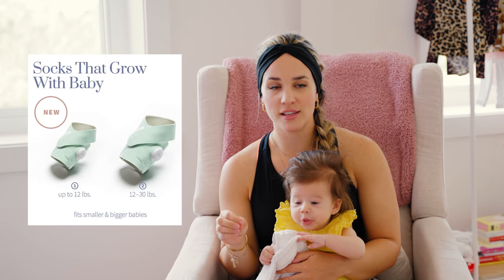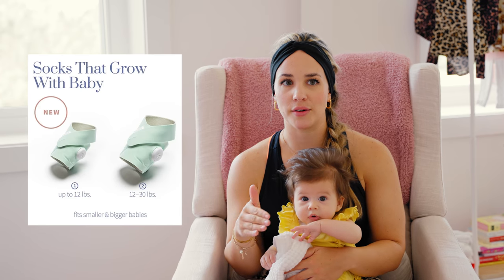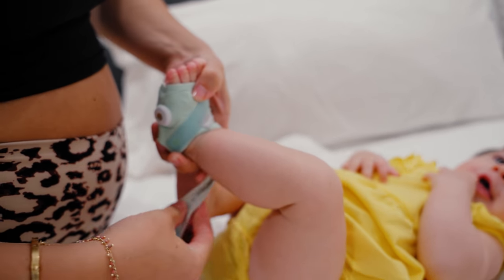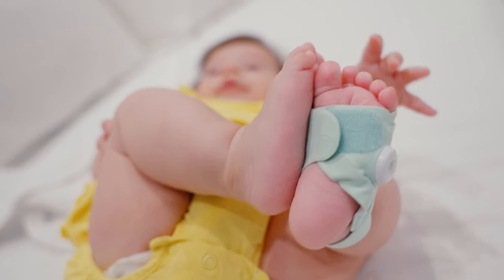The Owlet Sock comes with different size socks, so you can put a newborn sock on for either the right or left foot, or you can put a bigger size on for the right or left foot. I've heard the recommendation is to occasionally switch the foot that it's on, and that's what we've done. I have not had any issues with it falling off, ever. I always pay attention to how it's fitting and making sure it's not too tight or too loose, because that can affect the readings and it can also come off.